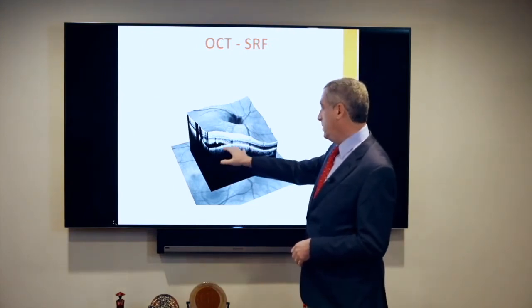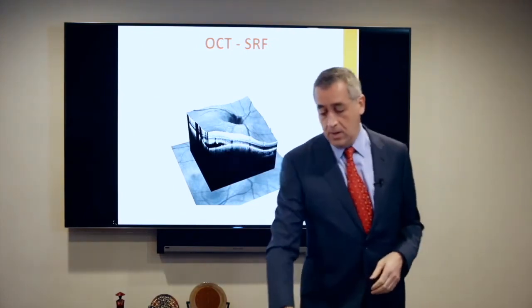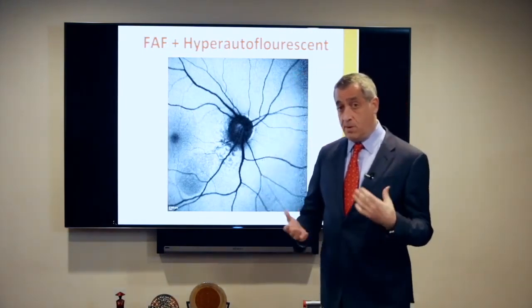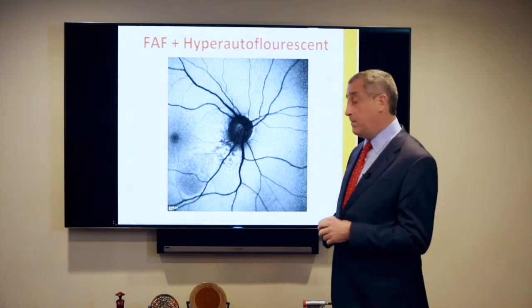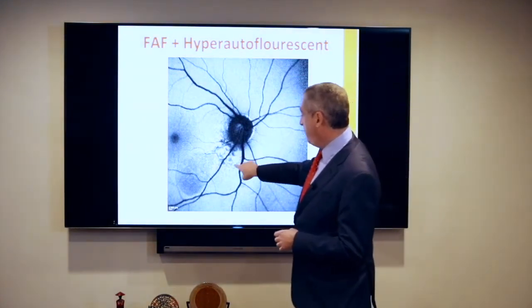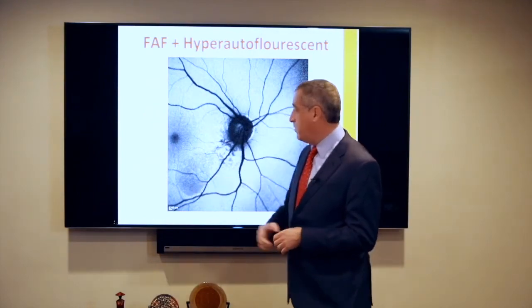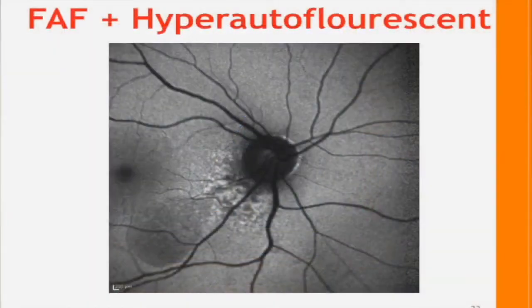So we have this tumor with subretinal fluid. On fundus autofluorescent imaging, and remember that was the best way to see lipofuscin, we can see definite hyperautofluorescence around the disc. We can also actually see the subretinal fluid, which may be quite fresh because there's not a lot of orange pigment in it. So this tumor has thickness, orange pigment, and subretinal fluid. With thickness of 2 or more millimeters, that's a melanoma.